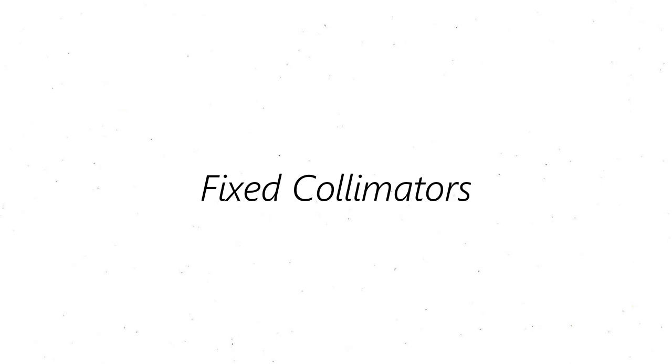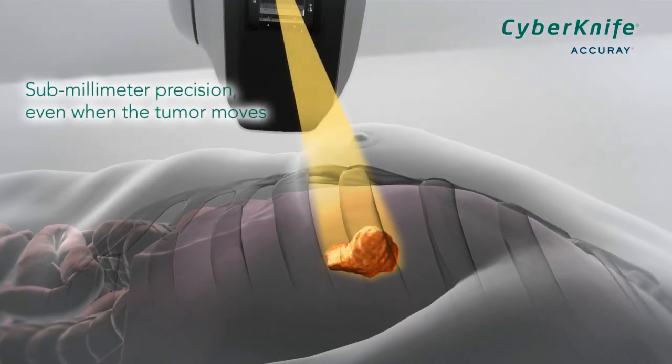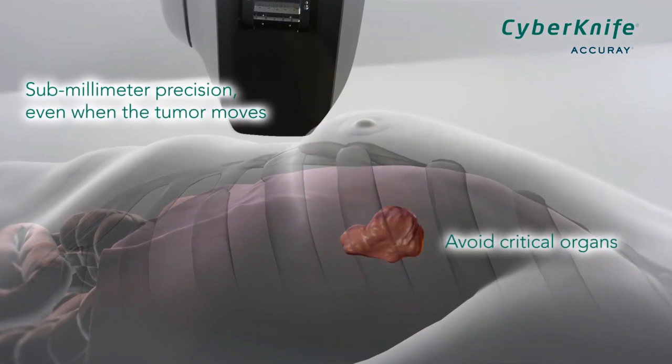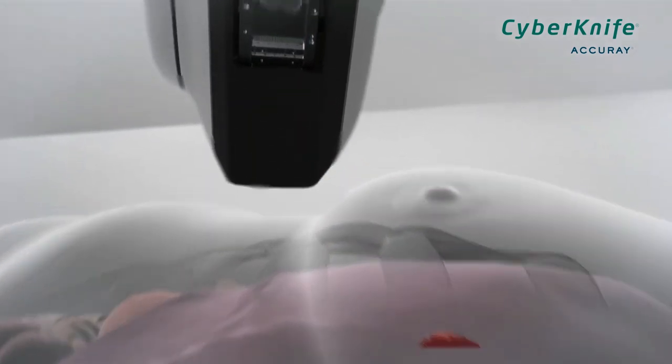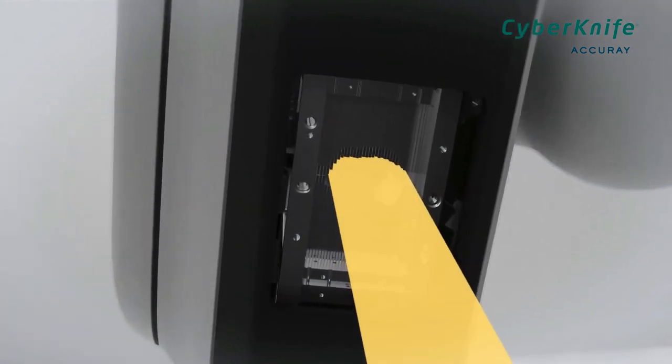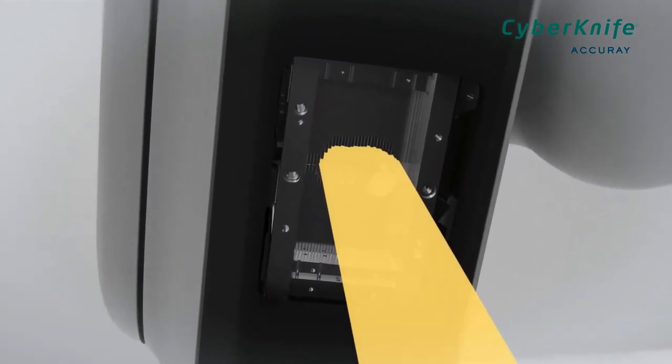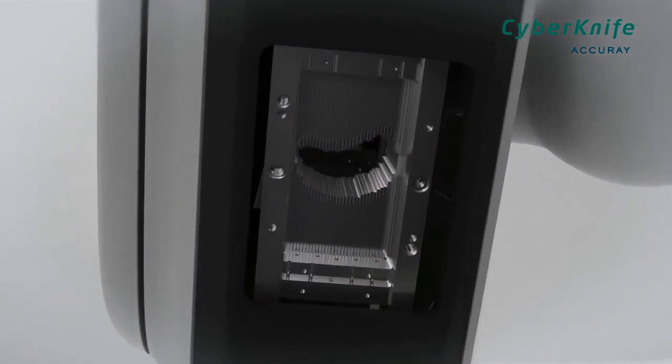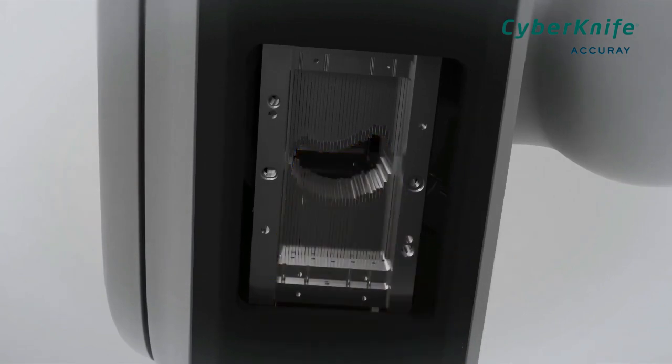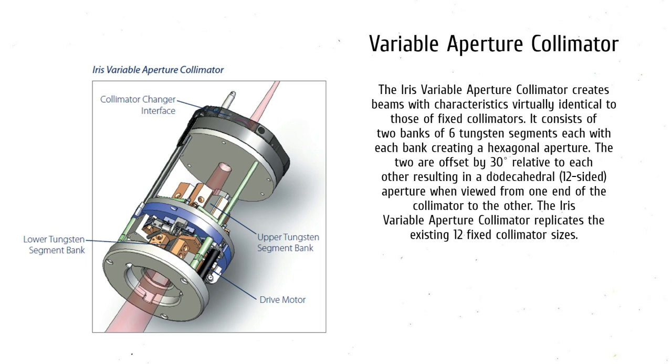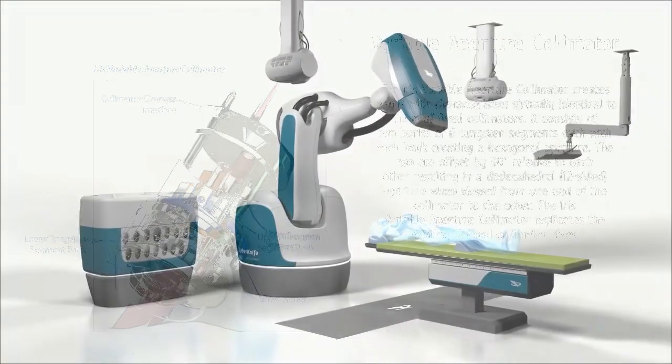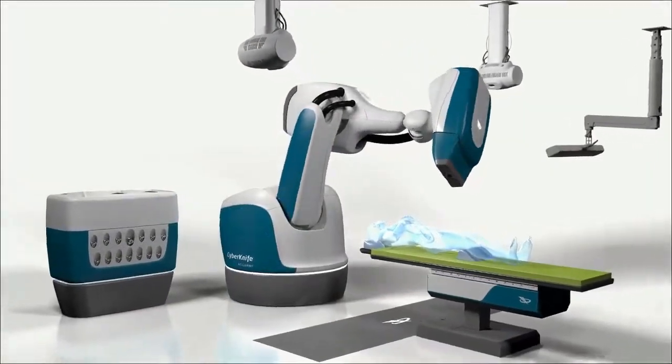The third component are fixed collimeters. The CyberKnife system is supplied with fixed secondary collimeters delivering circular field sizes of 5, 7.5, 10, 12.5, 15, 20, 25, 30, 35, 40, 50, and 60 mm diameter at 800 mm SAD. These collimeters can be changed to vary the beam size as generated by the treatment plan. For each fixed collimeter, the manipulator traverses a separate path.